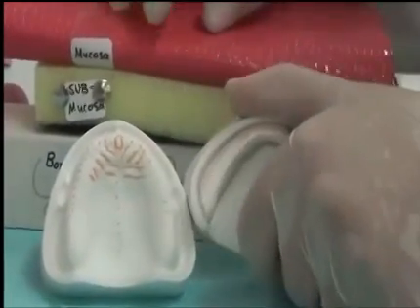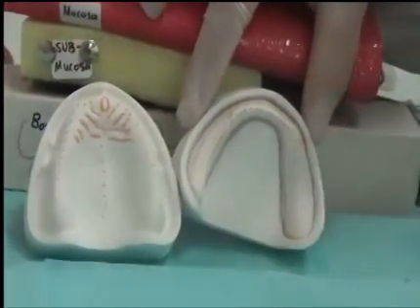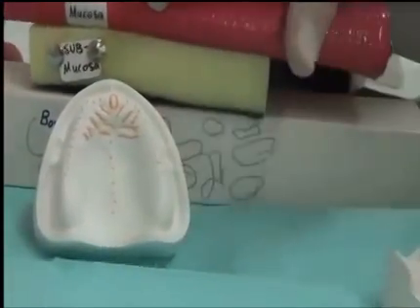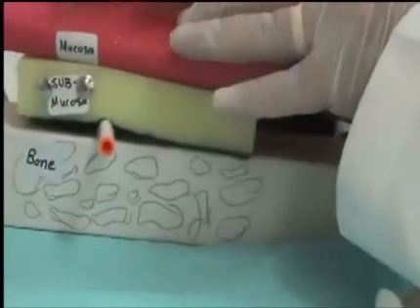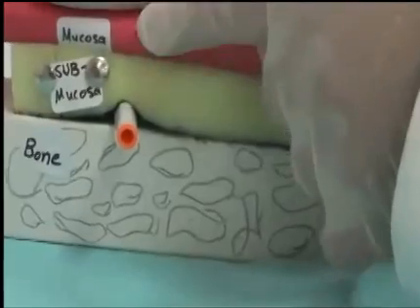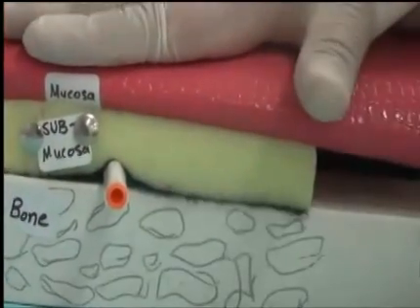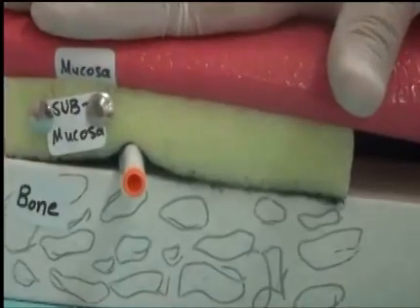And in the lower, that can be in the areas where we have knife-edge ridge. So this sharp bone spicule is present and the mucosa is pressed. The mucosa overlying it will be traumatized by this bony spicule. So those are also areas that need to be relieved.